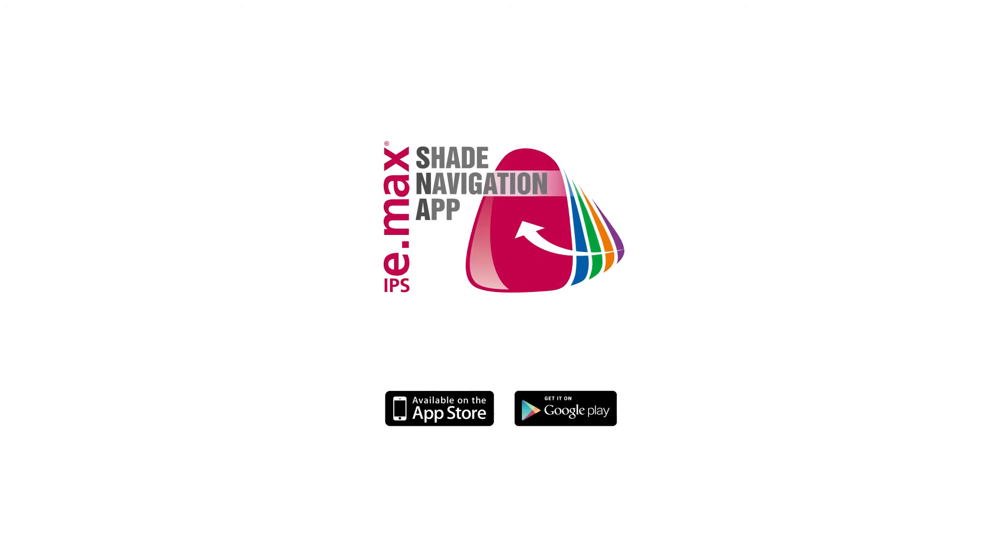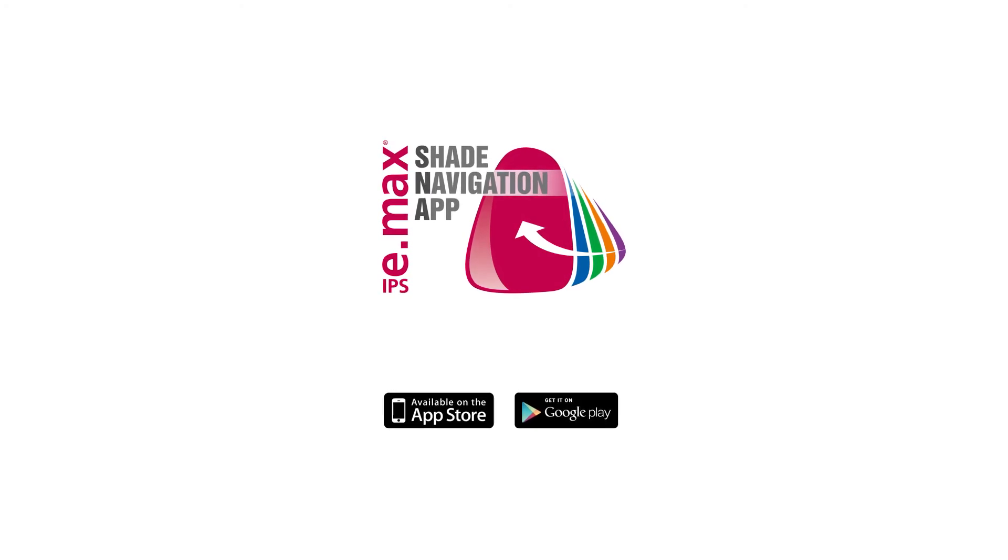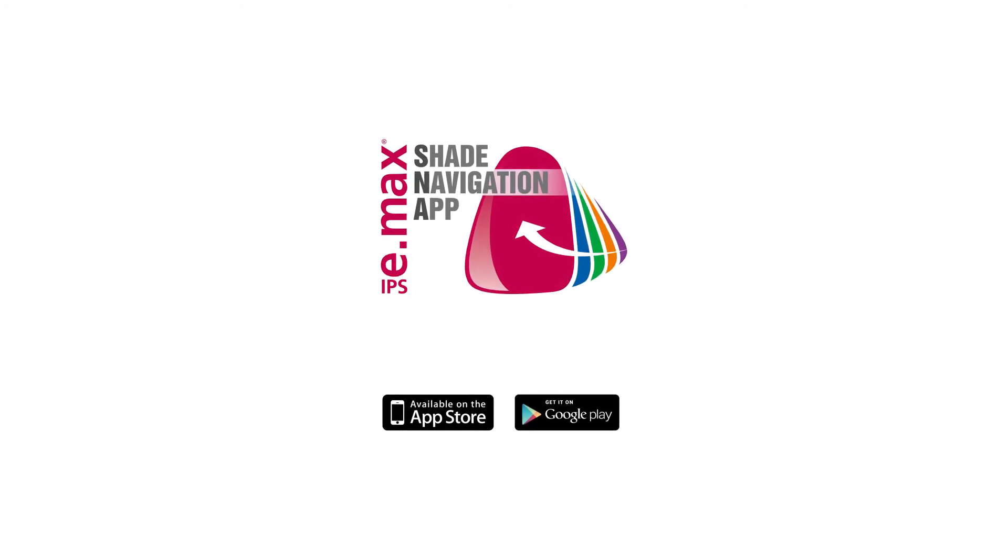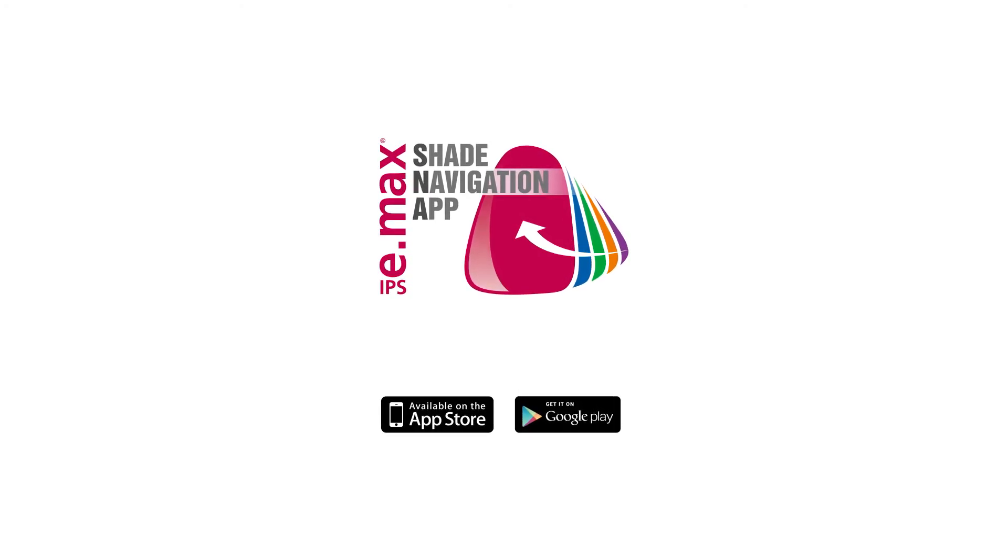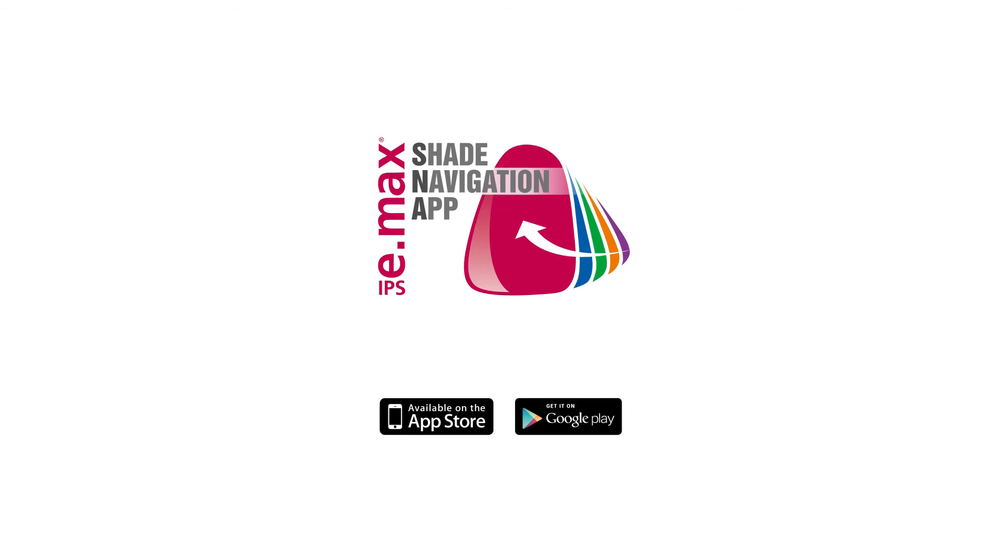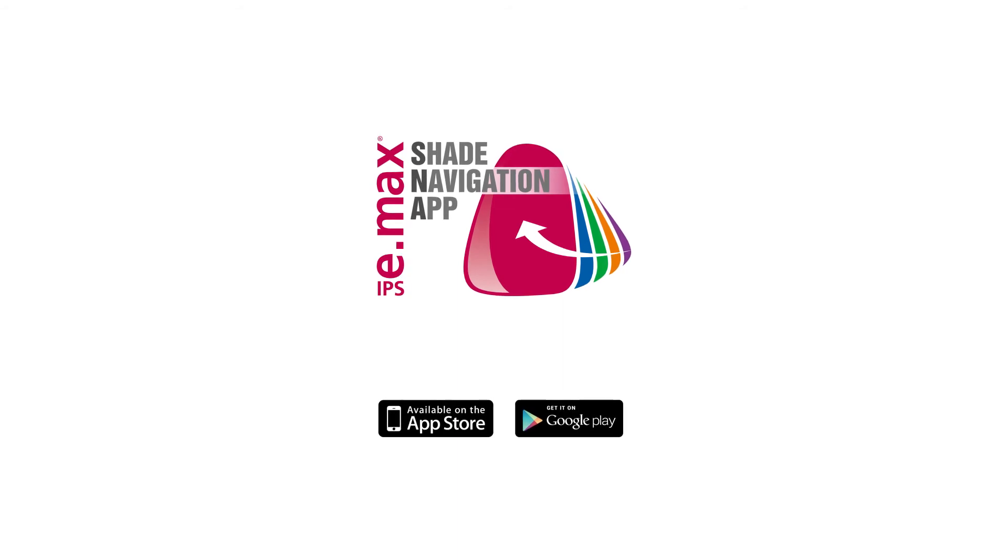IPS eMac's Shade Navigation app - shade and translucency always match.